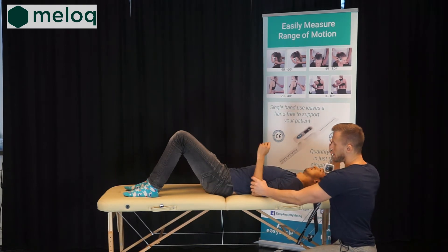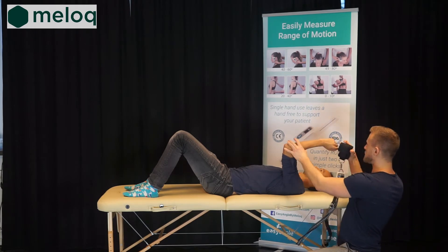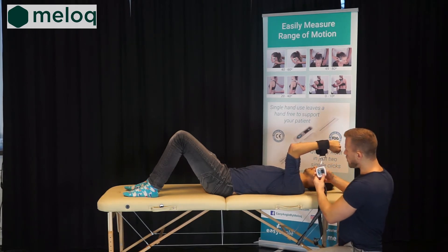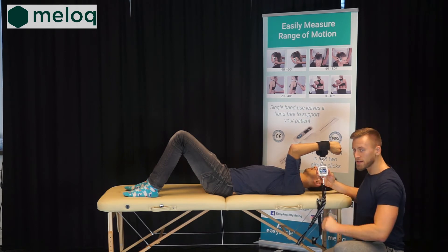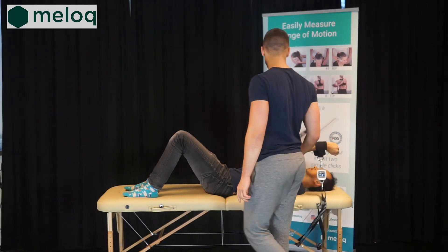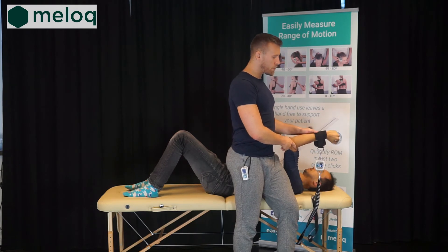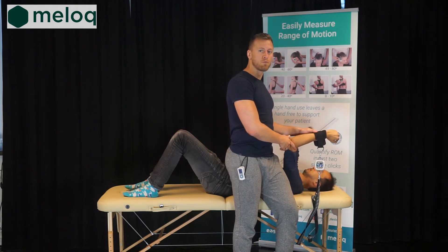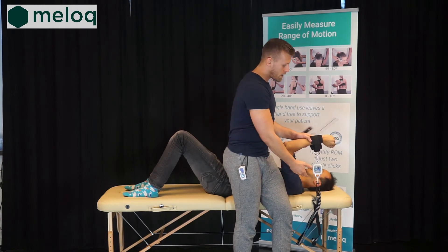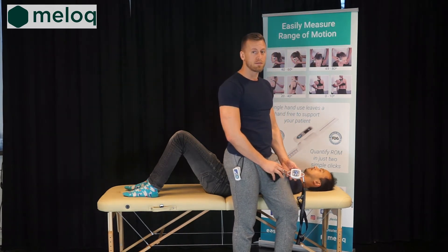We will bring the shoulder into 90 degrees of flexion and the elbow into 90 degrees of flexion as well. We will position the wrist strap, turn on the device and start the measurement while we stand up and support the patient as he performs the movement. We will hear the beeping sound — one, two, three — and relax. This is the end of the measurement.